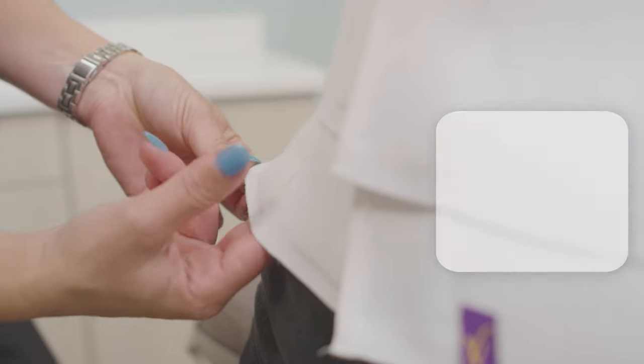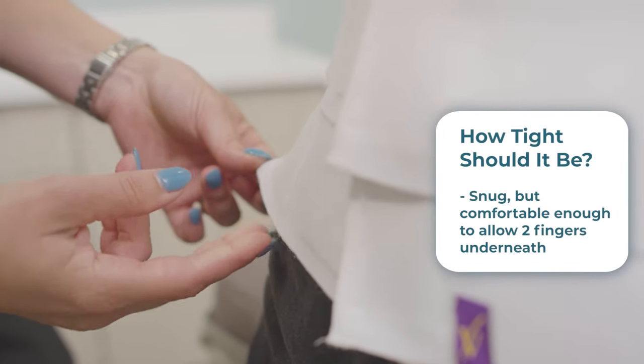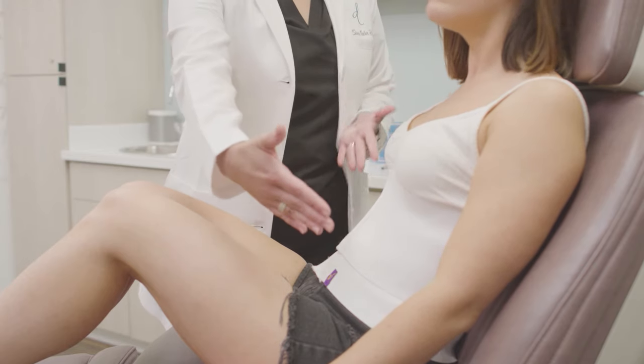Your abdominal binder should be snug but comfortable enough for you to insert two fingers underneath. You may wear a thin cotton t-shirt under the binder for extra comfort.